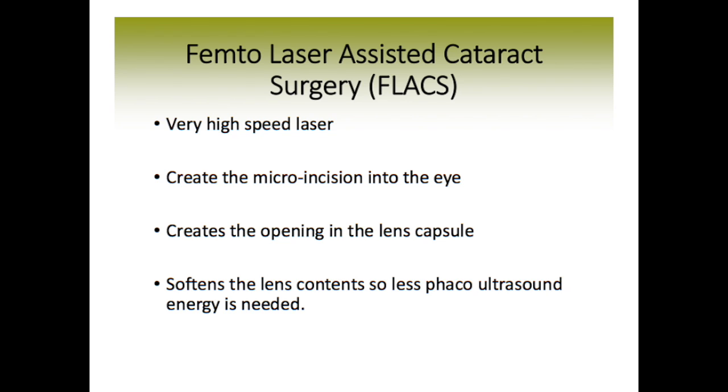So let's look at this. The laser-assisted cataract surgery utilizes a high-speed laser called a femtosecond laser. So it's abbreviated FLACS, femto laser-assisted cataract surgery.